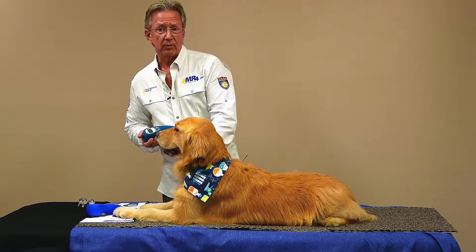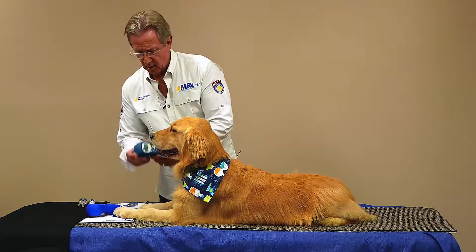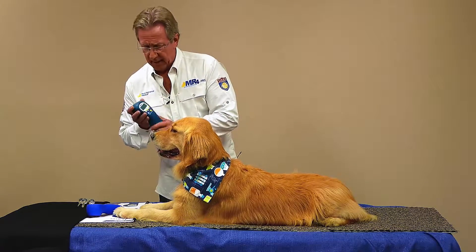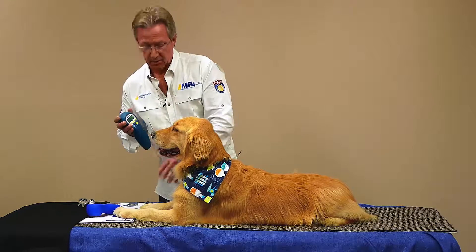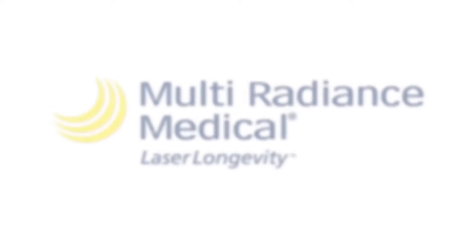So that's great for wounds. Again: analgesic relief along the spine, then come in and stimulate the injury site — first with your red at 50 Hz, then your blue for another two to three minutes over the injury. And that's it for wounds, but you can apply that to any wound anywhere on the body.